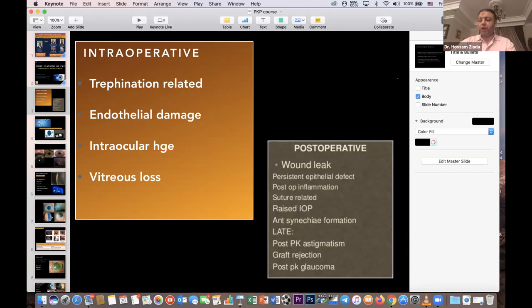Yeah, okay, it's a good idea to do the cataract before removing the cornea, but it's not available most of the time because most cases have a corneal opacity, you cannot see. If you can see, even hardly, to do the phaco, or you can use the endoilluminator to help your visualization, I will do it, but incisions inside the cornea may interfere with the pressure required for good trephination after that.